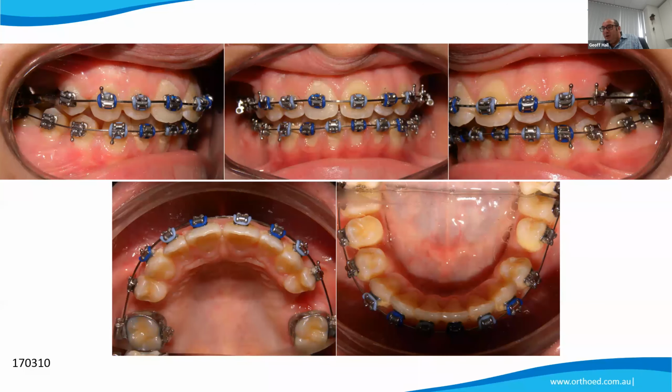module 7 with you guys, because when I expand that transpalatal bar, so if I make that transpalatal bar wider, so then I've got to actually squeeze it in, what's going to happen to the molars as well? Not only is it going to expand, what else is going to happen? Push the roots into the cortical bone a bit? Or, probably the other way. It'll probably tip, because I've now got a horizontal force on the palatal, which is going to tip the crowns out to the buccal. Yeah, that's what I meant.